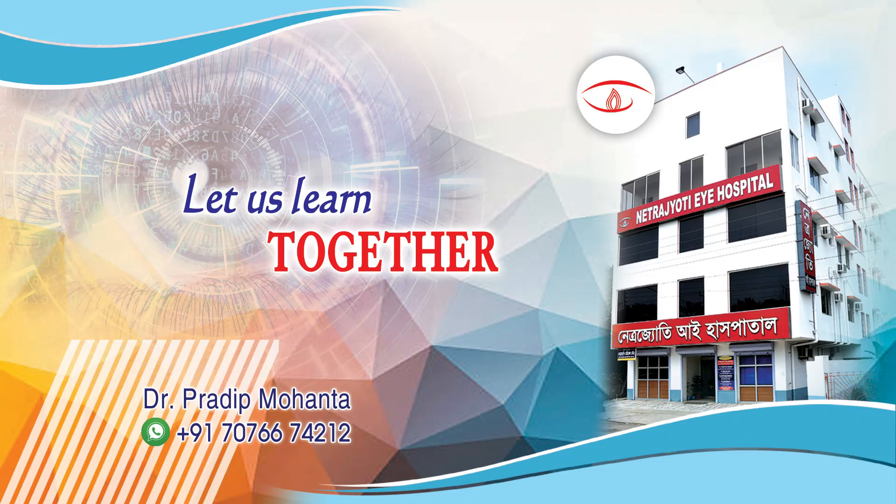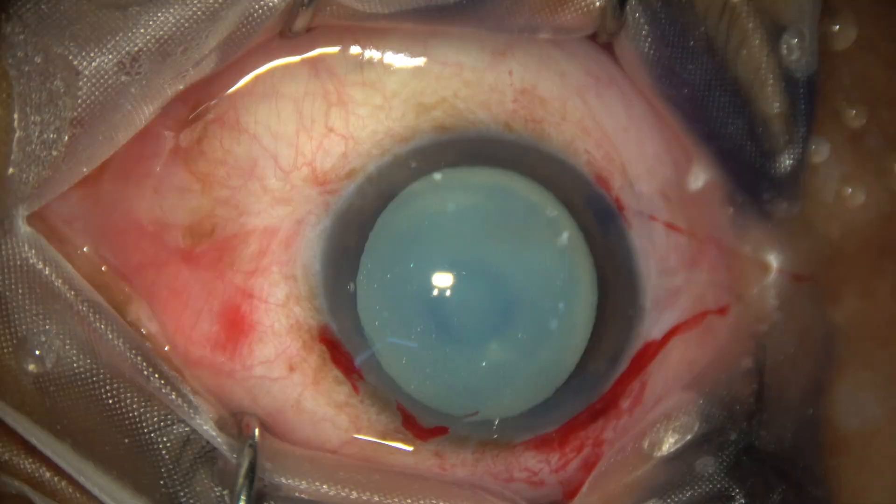Friends, welcome to my workplace at Ranakh Heart, West Bengal, India. This is a hyper-mature Morgagnian cataract. Let us see how we can manage this case.